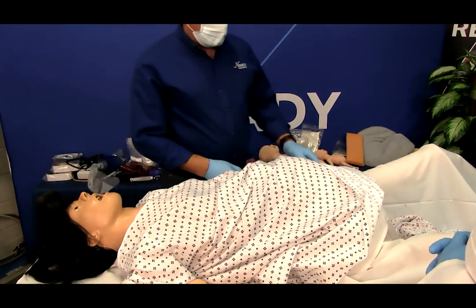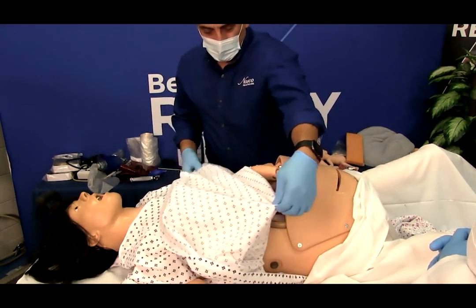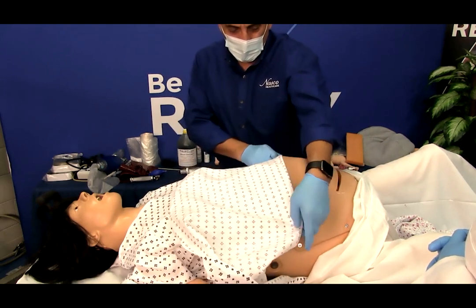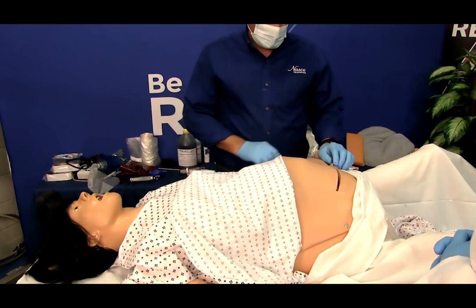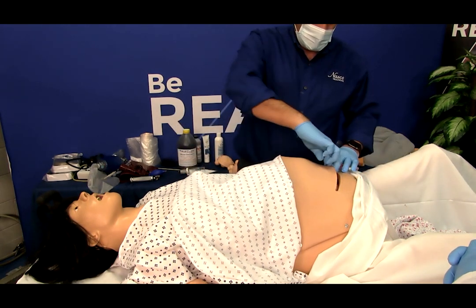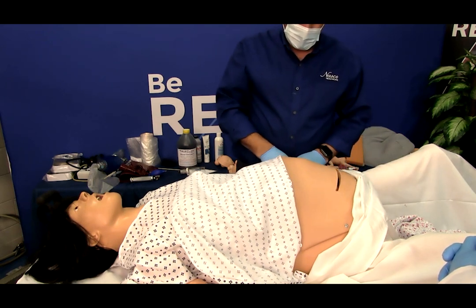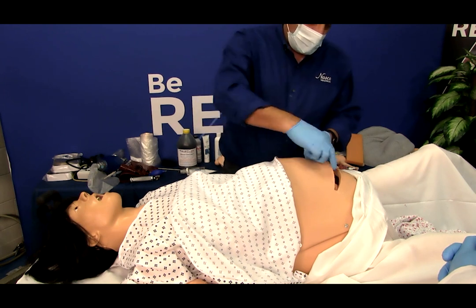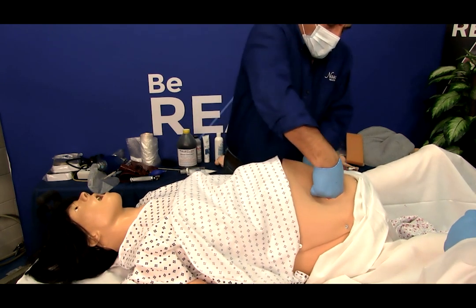To simulate a cesarean section, follow the instruction manual for proper steps to set up Lucy. Blood and cold cream may be applied to the fetus to add realism. Be sure to generously lubricate the fetus for easy removal and follow all institutional procedures for a cesarean section simulation. Now we will watch a simulation on a cesarean section.